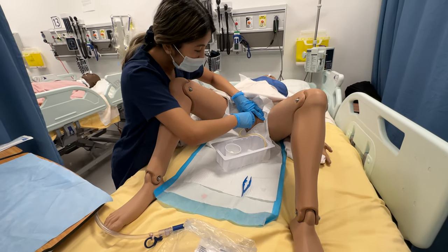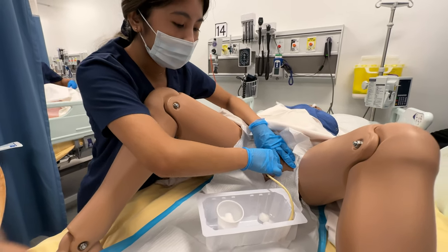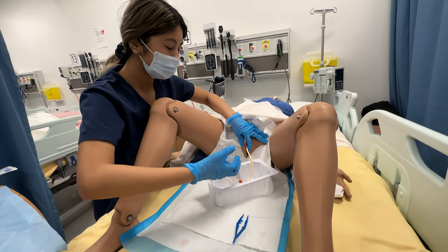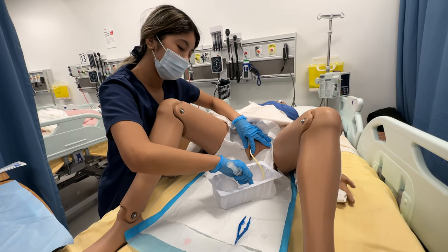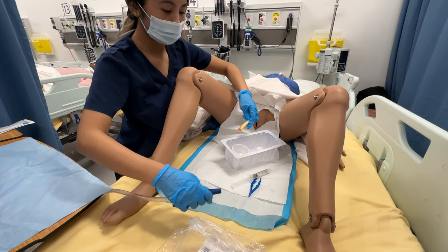I'm going to insert the catheter into the urethra, making sure it's in there. I know the catheter is inserted because I can see urine coming out. Once that happens, I'm able to inflate the balloon. Once it's inflated, I can fix it up to the side and attach the catheter to the drainage tube.